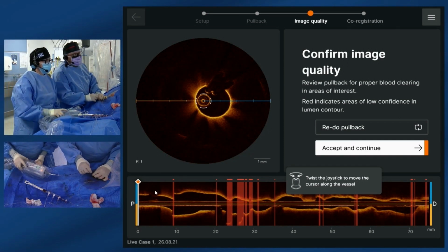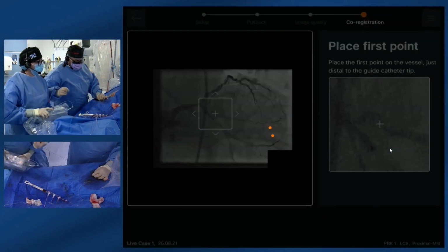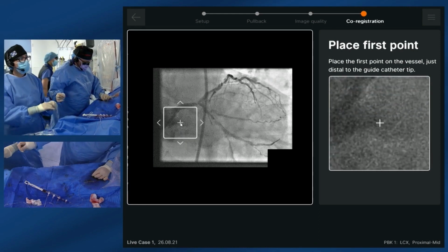Okay, good. So I'll just take this back. So ECG, he's obviously aware of the angiogram, but the ECG looks fine and his blood pressure is fine. You okay, sir? To give him 2.5 of morphine.